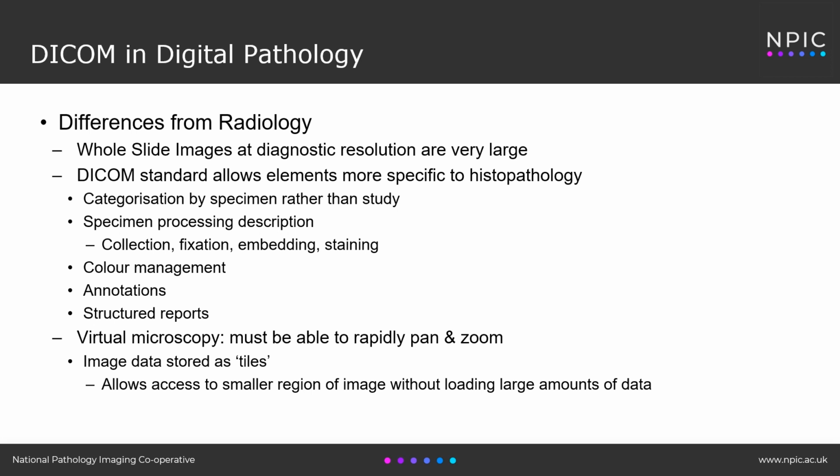It allows details of the specimen processing description to be recorded, such as collection, fixation, embedding, and staining, which may become much more relevant in particular AI applications as well as clinically. It allows color management, which again is more relevant in digital pathology as we're looking at full color images compared to a lot of monochrome images in radiology.